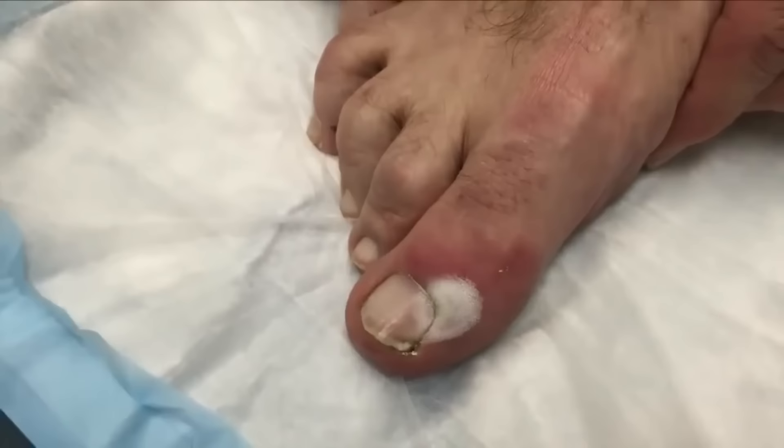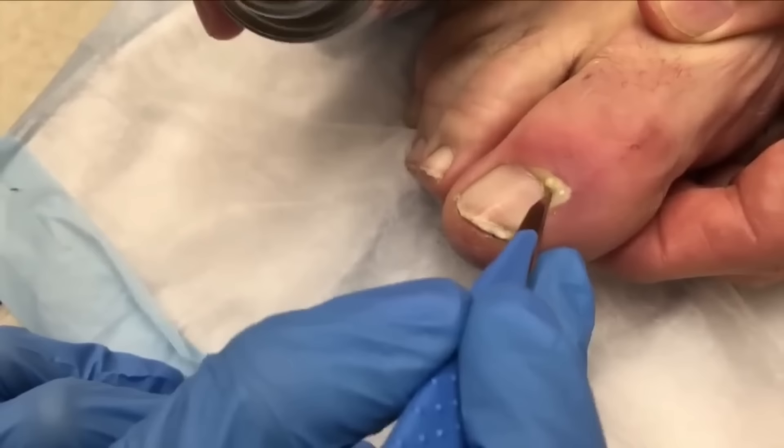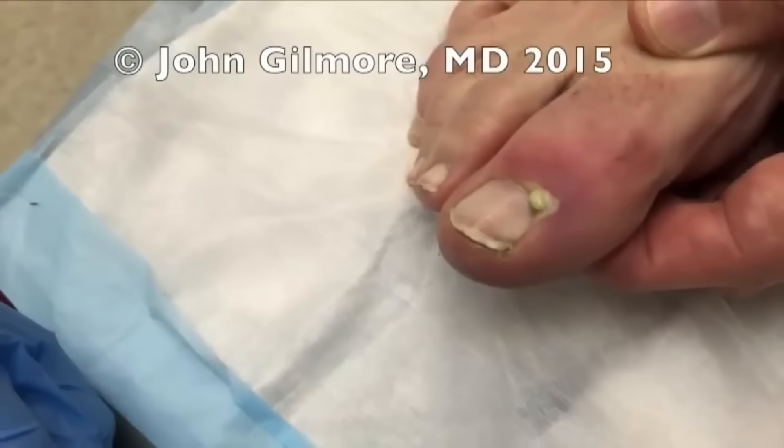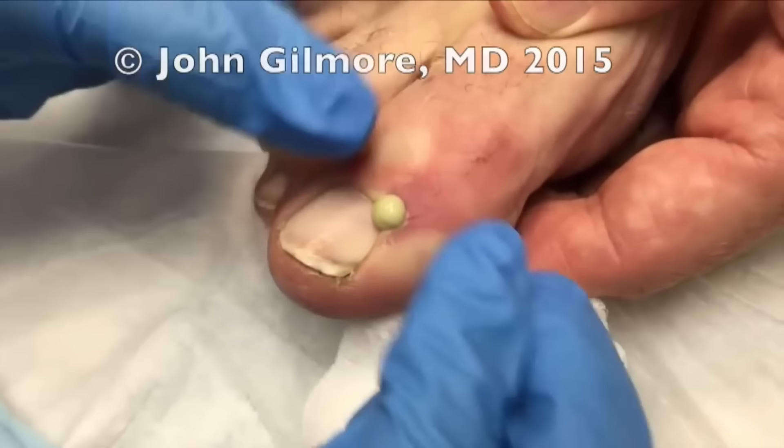Are you going to do it? Yeah, but you have to be ready. I'm going to spray this. You can do it right there — you need to make it a little bigger. There you go. Just squeeze a little bit. Look at that coming out of there.